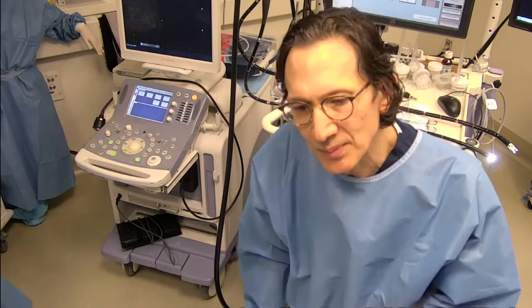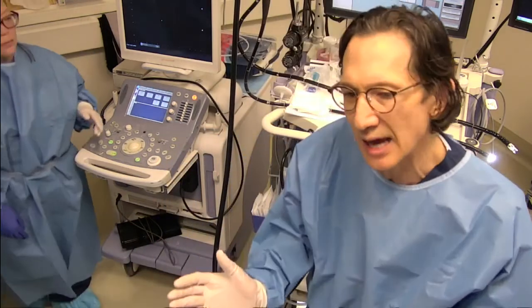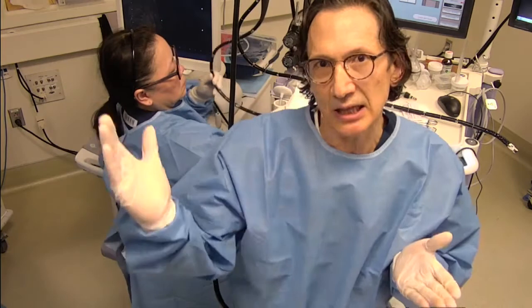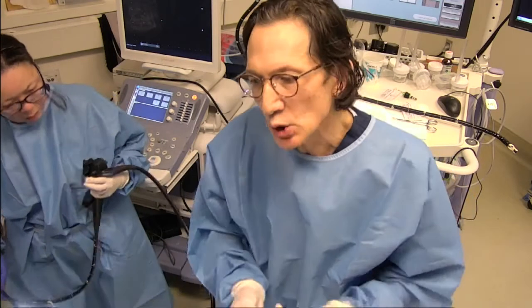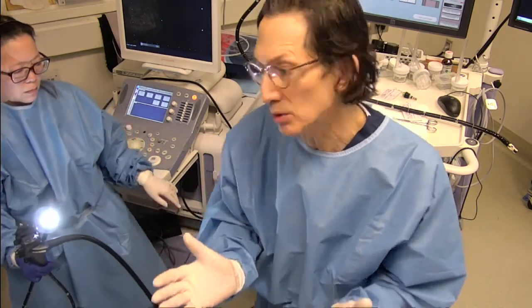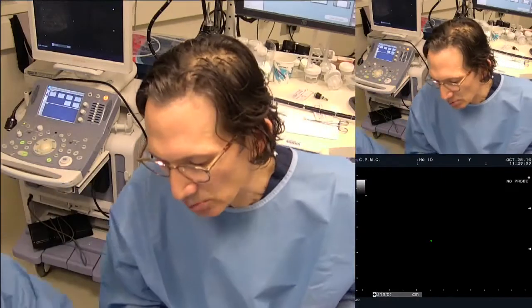There have even been ideas, as you read through the thousands and thousands of ideas and patents out there, that you could go in and ablate the mucosa of the gallbladder, right, with any kind of RFA, APC. You could ablate and obliterate, eradicate that mucosa and make the gallbladder afunctional. You could do that. So these are all options, and we'll see if any of these things make sense.